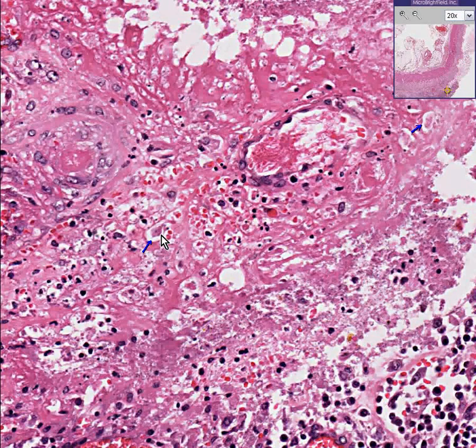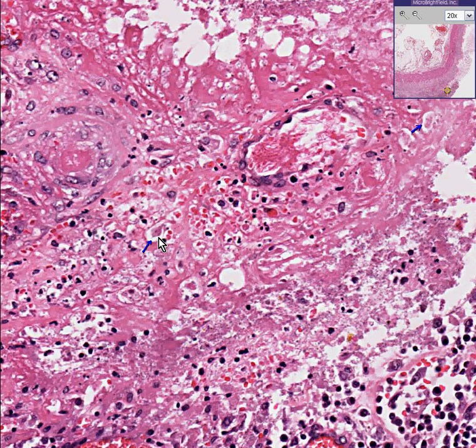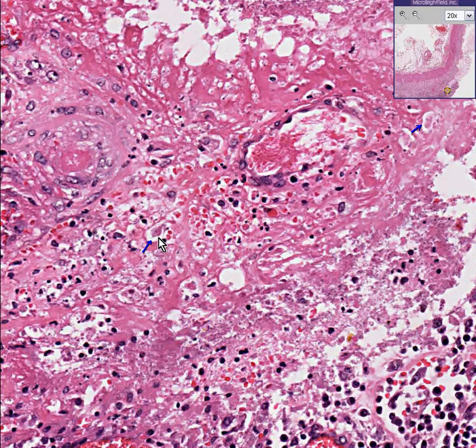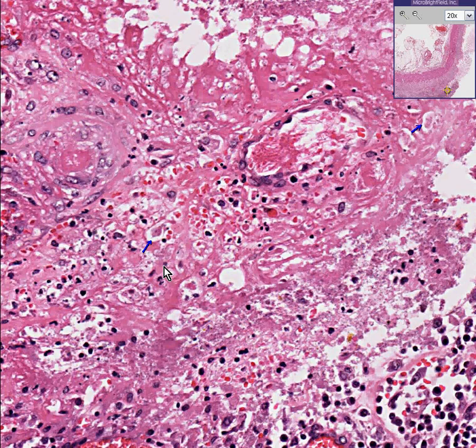These are amoebas. Quite frankly, you'd probably miss them unless you were really looking for them. You might think, oh, that's just a piece of smudge or maybe a macrophage. Amoebas do look like macrophages — they're about the right size and they have a granular cytoplasm — and if you didn't suspect it, you could totally miss these things. This is amoebic colitis.